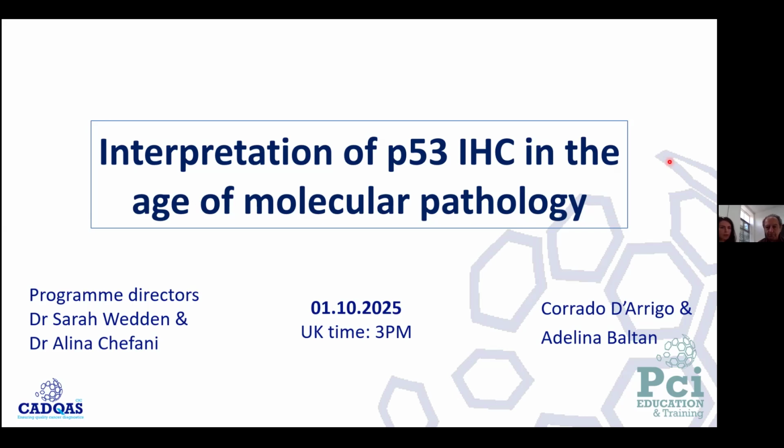Like Corrado says, P53 is one of these next generation immunohistochemistry markers that was a bit ahead of its time, because we're trying to recognize these mutant patterns that are a little bit more complicated than just looking at BRAF immunohistochemistry, where we see positivity wall-to-wall in the cytoplasm. It was ahead of its time because at that time, immunohistochemistry was not very well optimized. It was used in research.